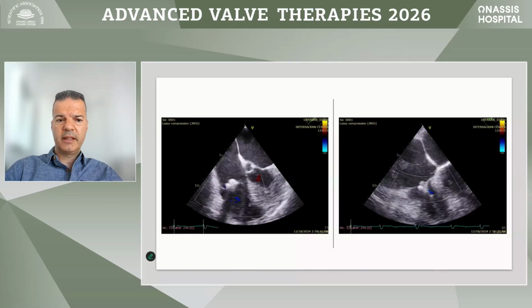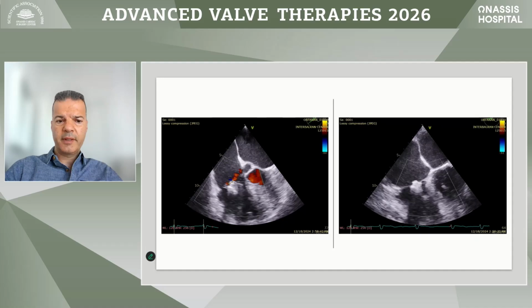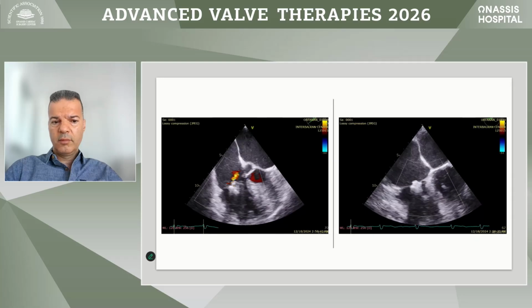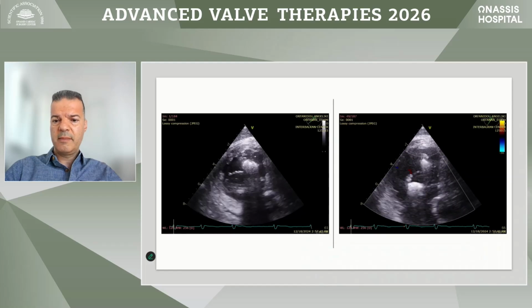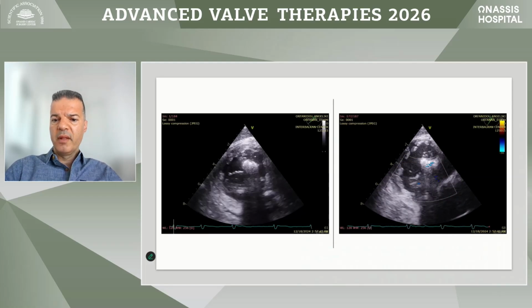So this is the clover technique. And actually, this is the final result. You can see there's a trace of tricuspid regurgitation. Admittedly, this is a good case. This is an AF case with preserved LV ejection fraction, with very good imaging. But these are the cases that we should be doing. The patient was severely symptomatic, but not fully decompensated, as you could see.